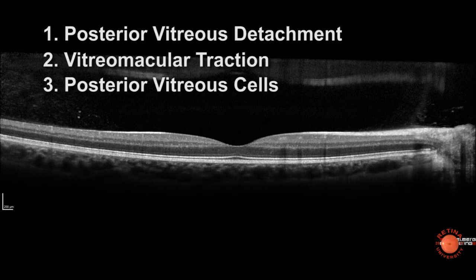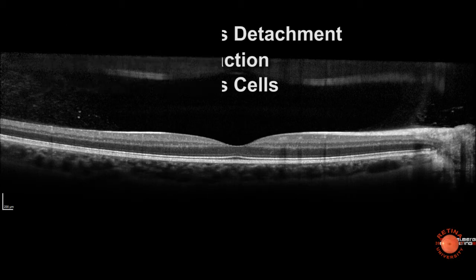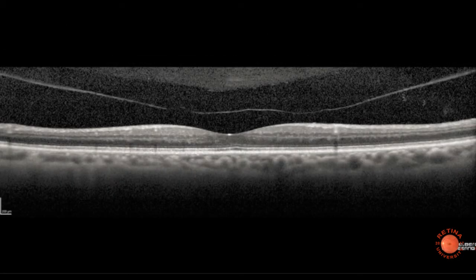The vitreous is normally attached at the optic nerve, the macula, and the vessels. This is where you might look for an attachment when you're looking for a posterior vitreous separation. This scan I captured over the optic nerve was from someone who was having some floaters, and I could see that the vitreous had partially separated but was still attached at the nerve.